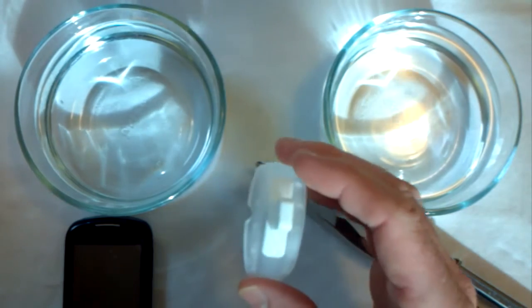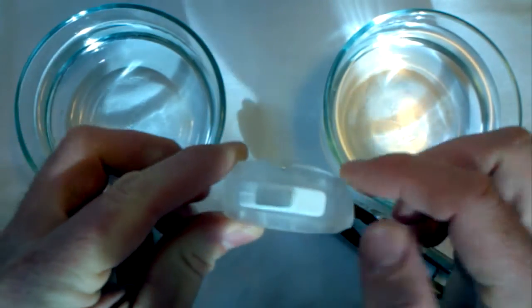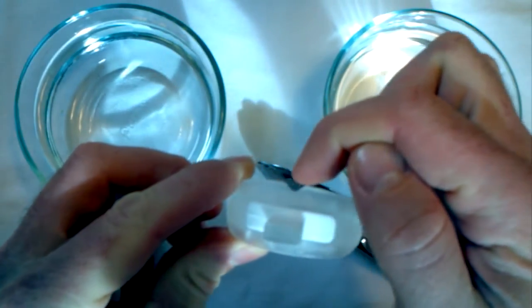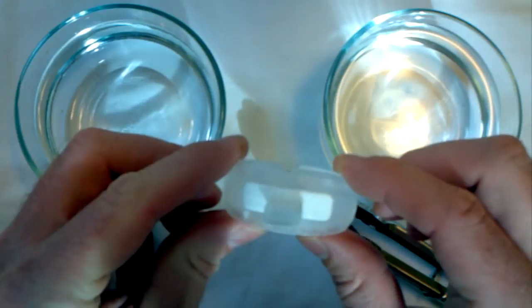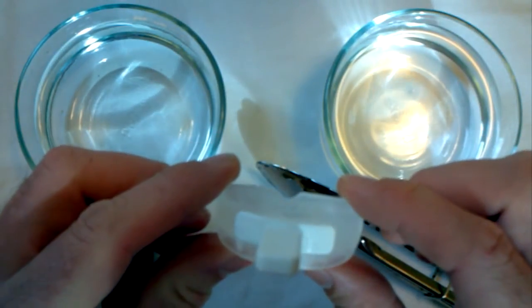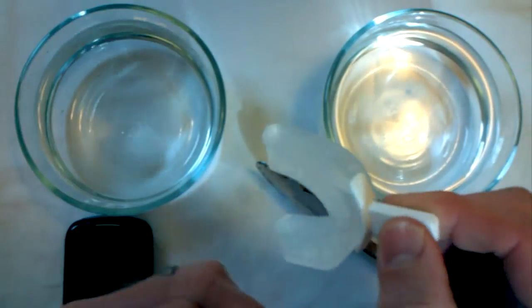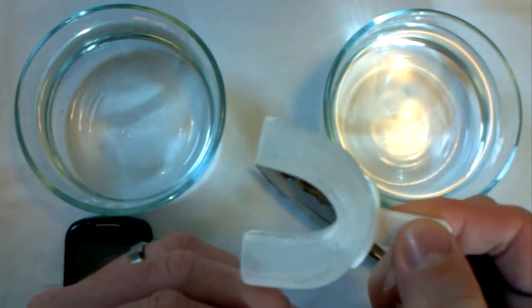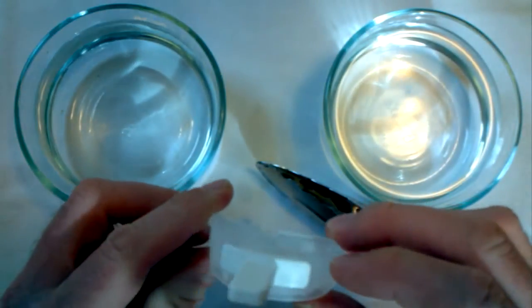This part's very important. Make sure that this notch here at the top, you can see there's a V right here at the top, goes into your mouth at the top, and it's going to go in just like that. Before you put it in your mouth, make sure that it's not too hot, so you're going to want to touch it to your skin and make sure it's not scalding hot. But you don't want to let it cool for too long, otherwise the plastic will harden.